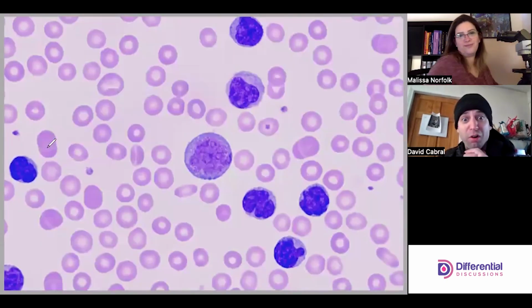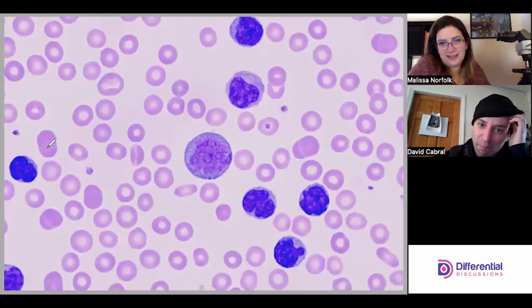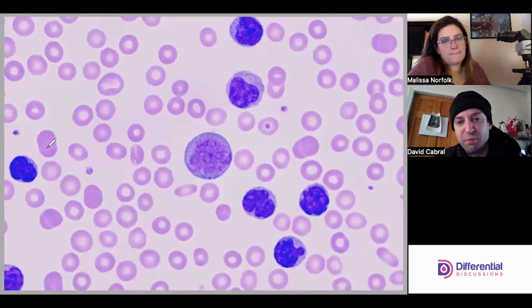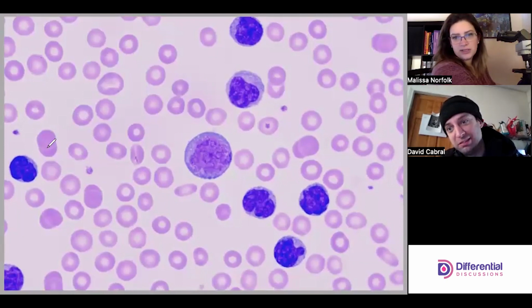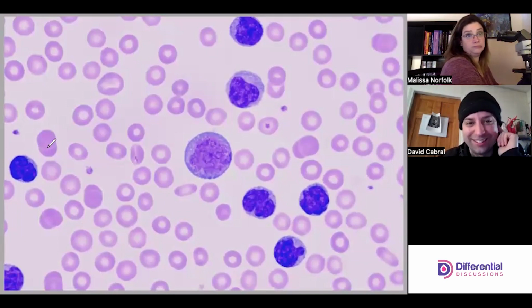There's a guy. And this is the point where a pro-lymphocyte might start to look like a blast almost, right? It really starts to aggravate the morphology. It gets more extreme. Really cool though. It looks like a lot of nucleoli. Yes, you can see at least three or four. Four, maybe five. And troubling.